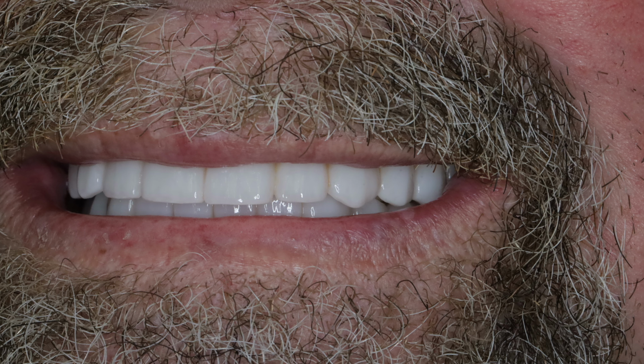Let me just tell you, I've never had a patient unhappy with the final prosthesis in these. And they are worth the money because they are a lot of money, but they are worth it. They are almost like having your teeth back, and you can go about with confidence in both eating, smiling, talking, everything. These are in there and they are solid.